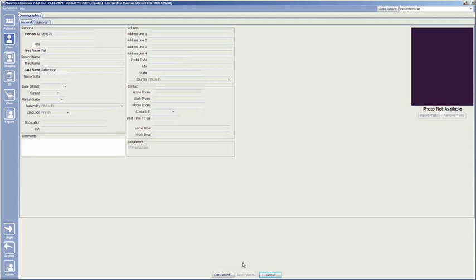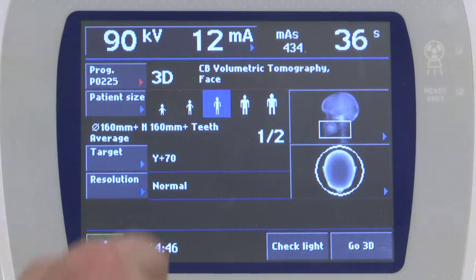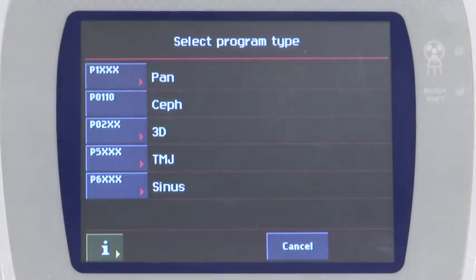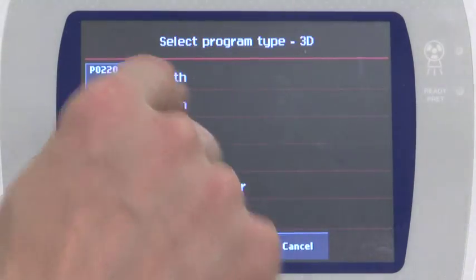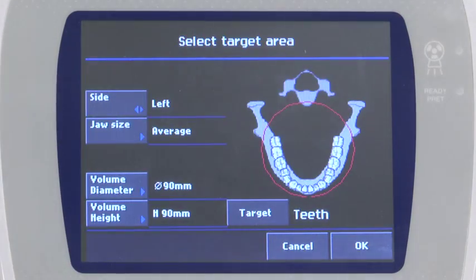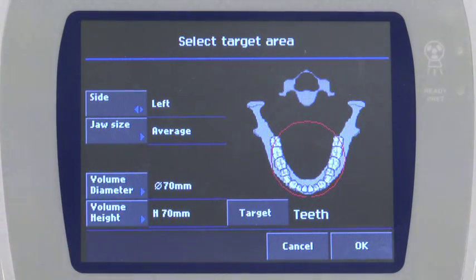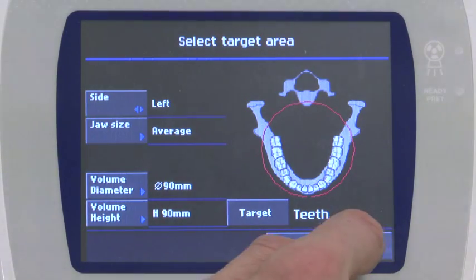Select 3D on the left pane. Select the program by clicking the program button and select 3D. Select the teeth program. Select 90mm for the volume diameter and 90mm for the volume height. This will provide a 9x9cm volume. Select teeth for the target, then click OK when the target selection is complete.